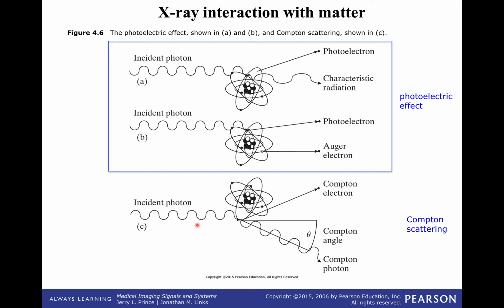So where are we now? We've created a photon, it's coming out of our X-ray tube, it's going into a patient, and it's now going to interact with molecules in fat, bone, liver, blood, contrast agent, stuff like that. If the X-ray goes all the way through the patient, we get a detected event on the other side. And if they all went through the patient, you wouldn't have a picture. All you'd see is a bunch of X-rays. There'd be no contrast. But they don't all go through. What you image is the shadow, the differential absorption as a function of position through the patient.